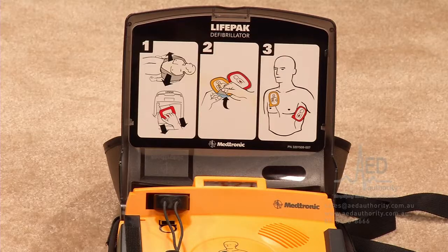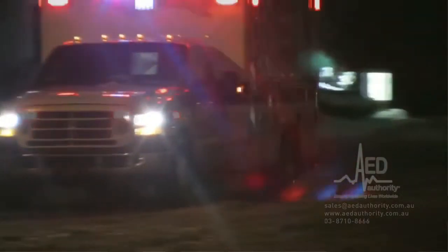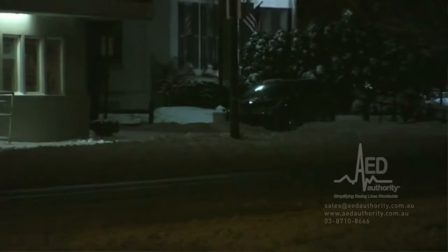That's it. Just do what the AED tells you from the moment you turn it on. When the emergency medical team arrives, you may have saved critical time by starting treatment — and even better, you may have saved a life.